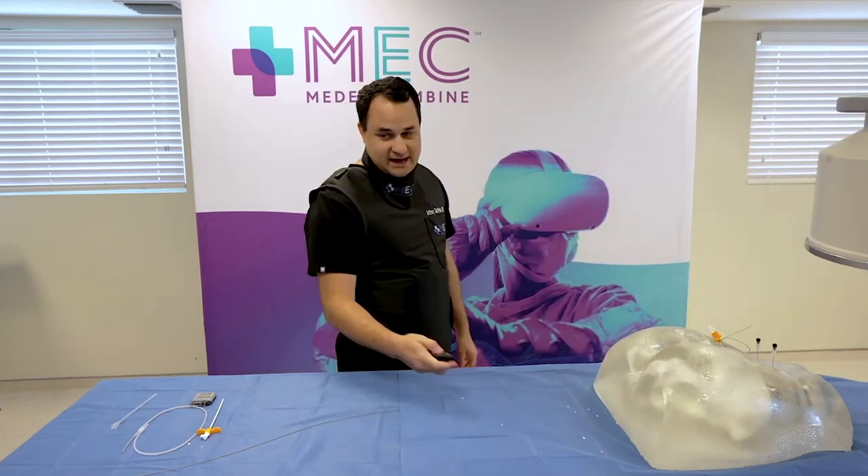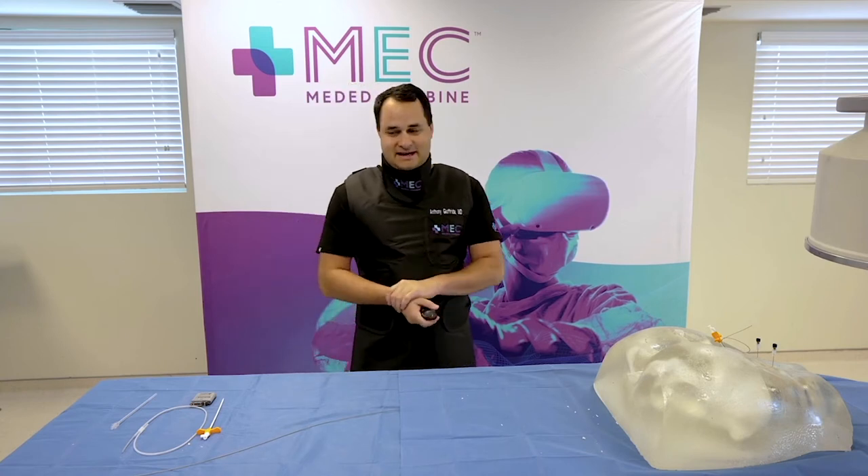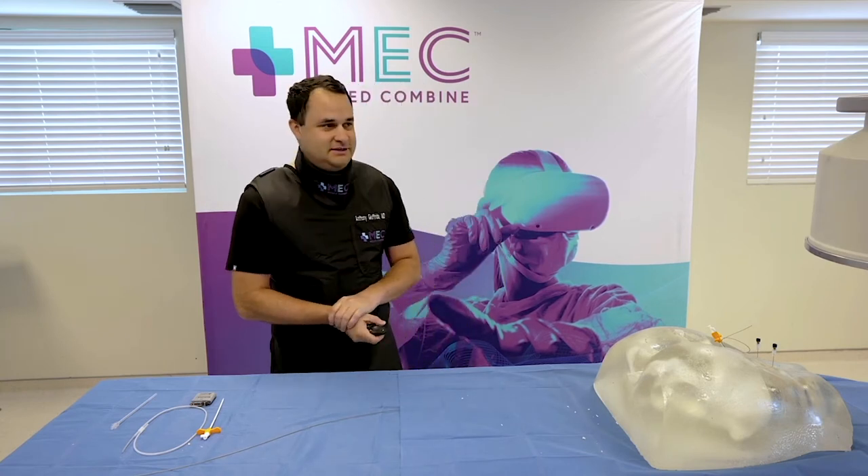We're on to our next segment. We're going to have the guys from Mainstay Medical, and we're going to be showing off the ReActivate procedure. Come on in.